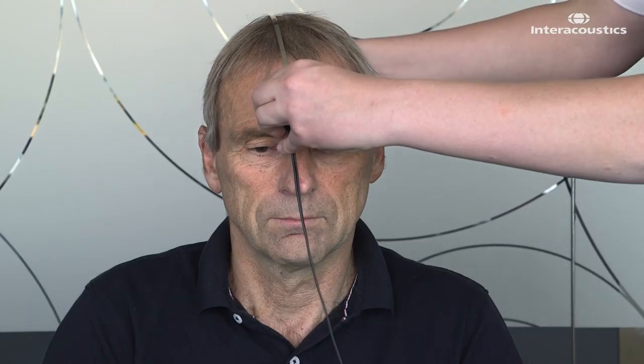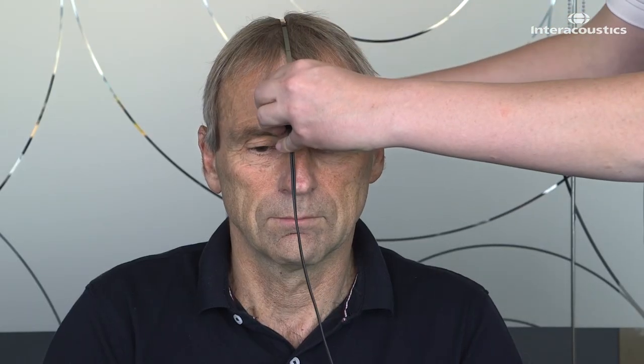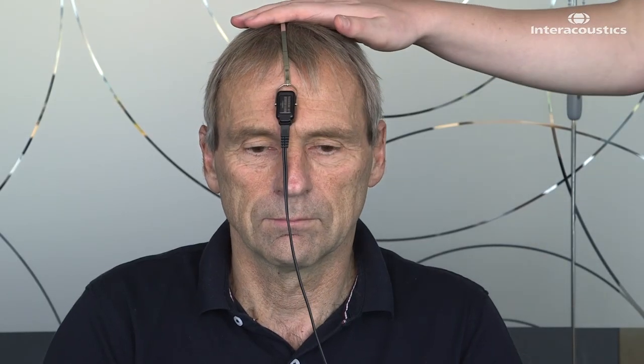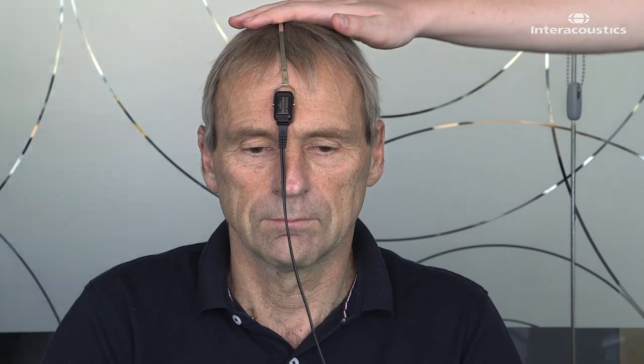The test works in a way that you need to first of all place the bone conductor. The bone conductor is placed with a forehead placement, so you place it on the forehead of the patient like so. Make sure that the headband sits tight to the patient's head.